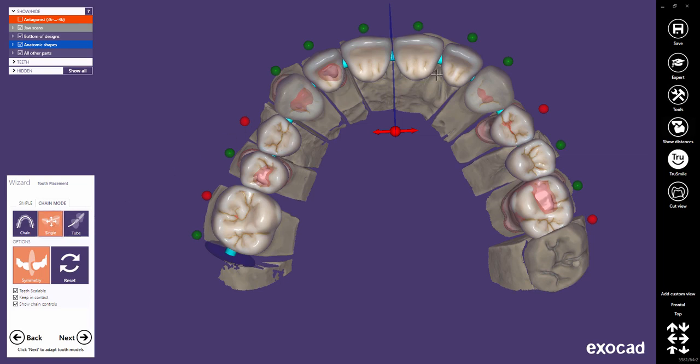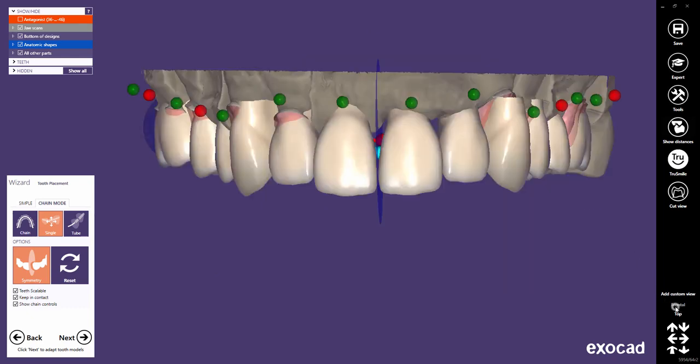With a plane in single mode, you now have a perfect configuration to do some fine tweaking on the anteriors, which will make it very easy to design symmetrical anterior setups. Note that in symmetry mode, even changes on control points will be mirrored.